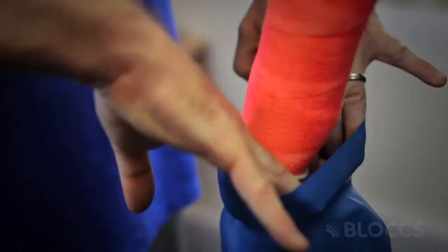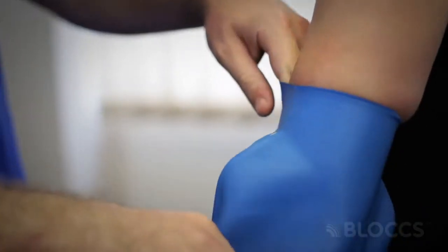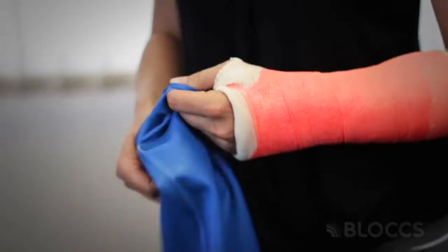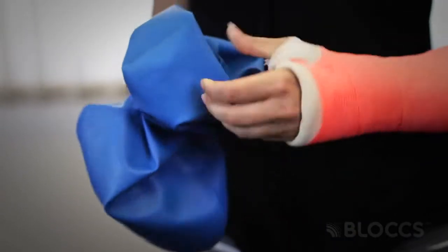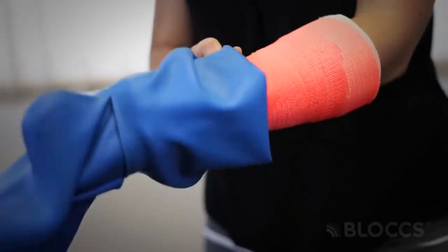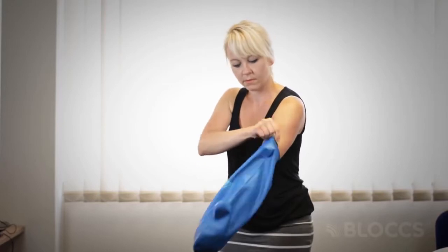There are two simple ways of applying your cast cover. You can either — especially if you've got help — stretch the top of the cover and place your arm or foot into the cover, then pull it up to seal just above the cast or dressing. Alternatively, you can roll the cover down, place your hand or foot into the product, and roll back up to seal above the cast or dressing.